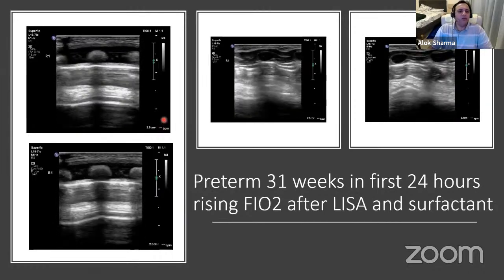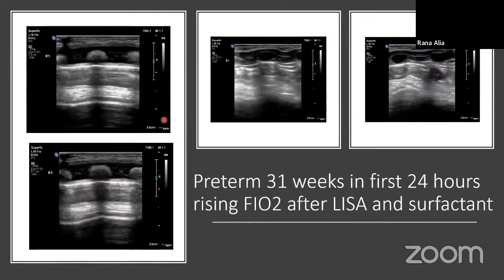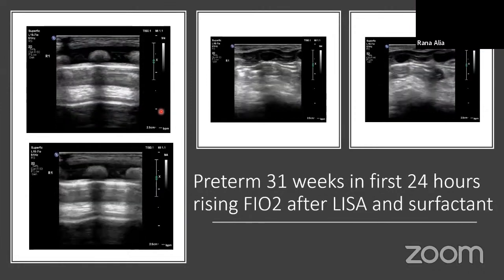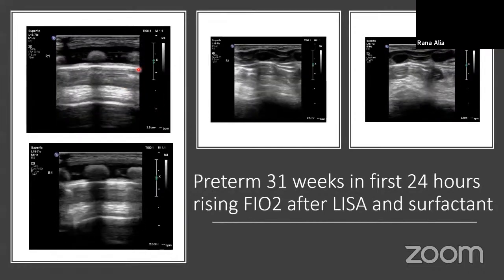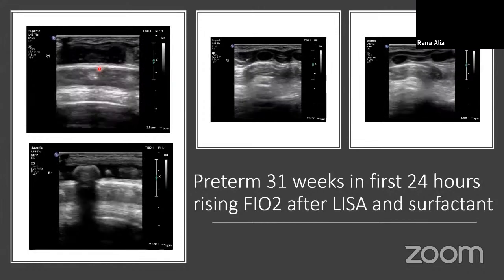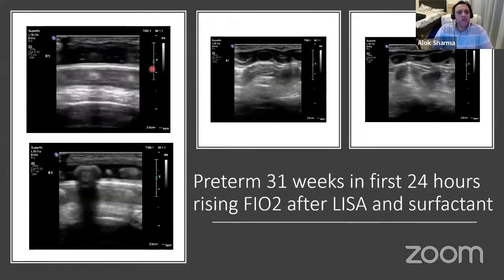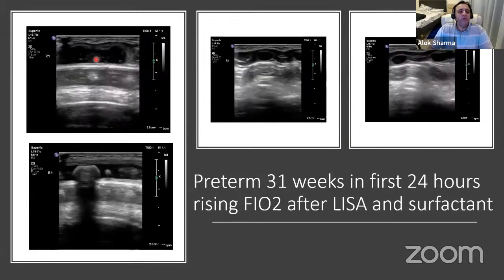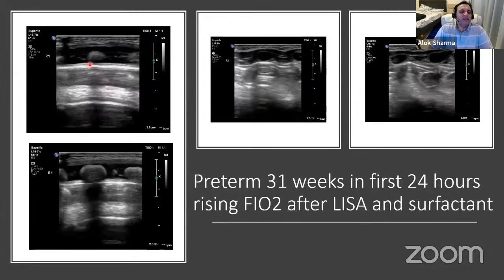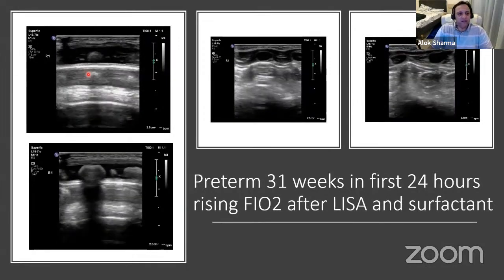So the pleura you thought was irregular? It looks regular, a little bit thickened. Okay, so it's thickened, but do you think it's regular? It's regular, but it does look a little bit thickened. Beautiful. I completely agree with that. So you've got a bat wing sign, you've got 2 ribs, you've got the pleura in between. So I've got 2 bat wing signs there, and pleura that you're correctly identifying as thick.